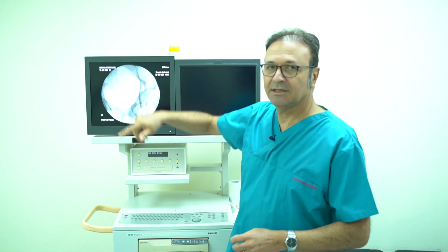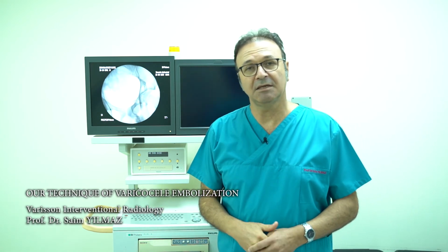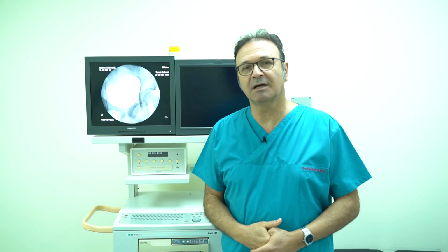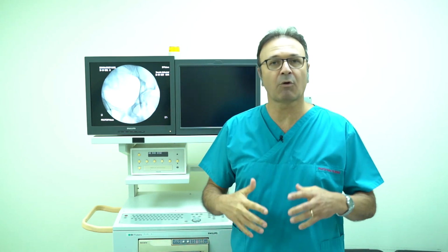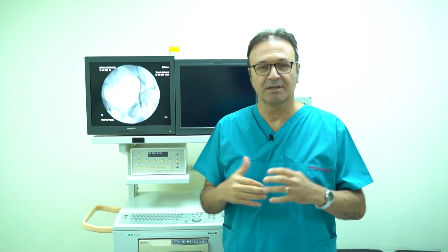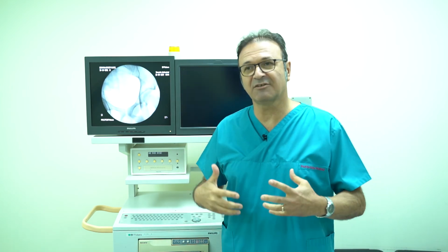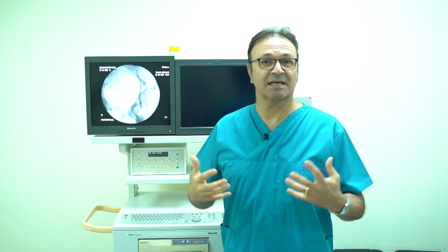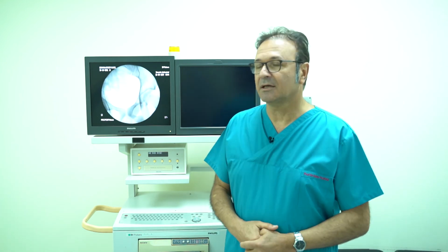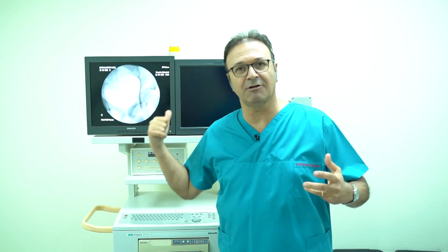Then we withdraw the catheter into the refluxing vein, the left internal spermatic vein, and we either advance microwires that we call coils, and in this way we occlude this vessel instead of ligating it surgically, or we can inject a material like glue or cyanoacrylate into the vessel while the patient is performing the Valsalva maneuver or straining. In this way, we can occlude the refluxing vessel, which is also the reason of the varicocele.